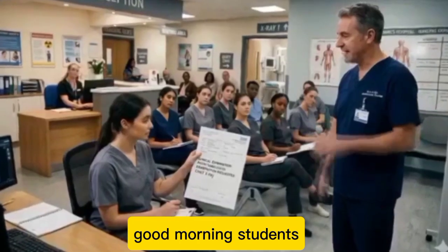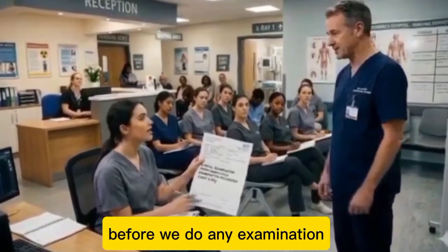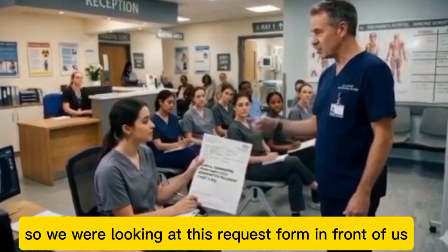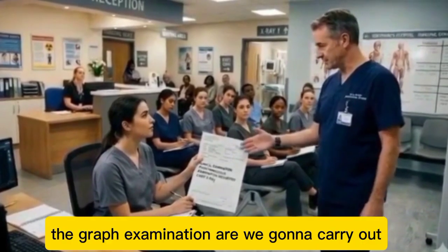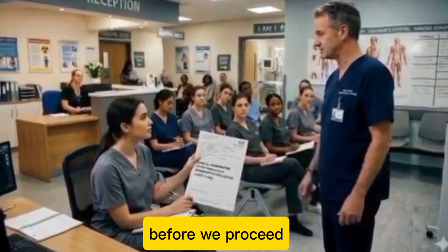Good morning, students. As radiographers, we always begin by checking the request form before we do any examination. Yes, doctor. The request form guides us on what investigation the patient needs. So looking at this request form in front of us, I want you to tell me the radiographic examination we are going to carry out. Think carefully, and identify the exact examination requested before we proceed.